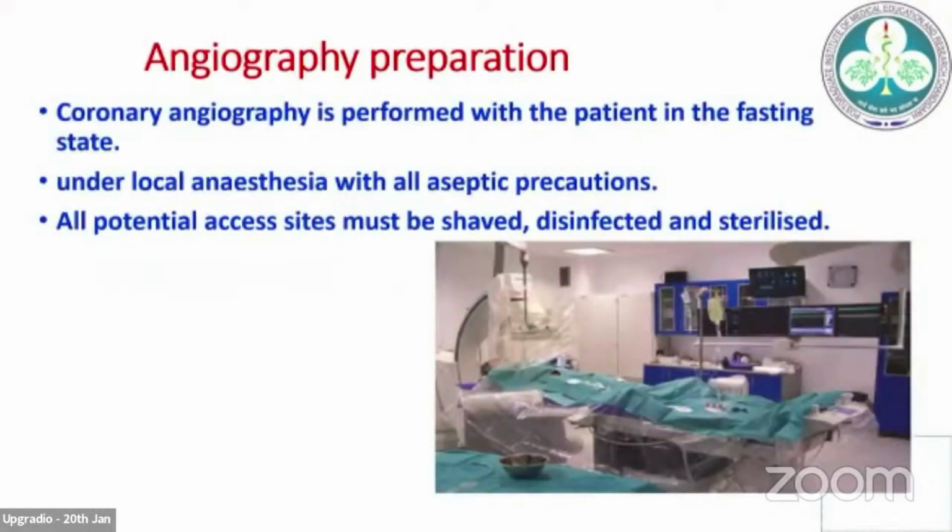As you all know, this is the cath lab scenario, where we work in a central cath lab with the monitor and defibrillator on the side. For routine angiography, we have the patient fast for 6 hours. Though it's not routine to have no fasting, sometimes an emergency situation can arise and then you are supposed to have intubation and anesthesia backup.